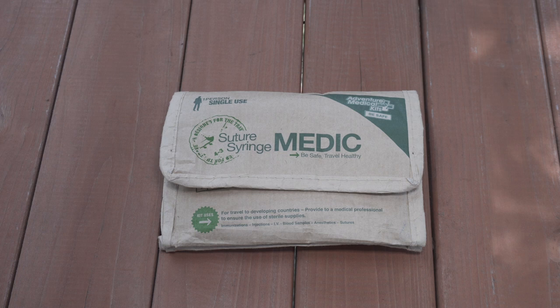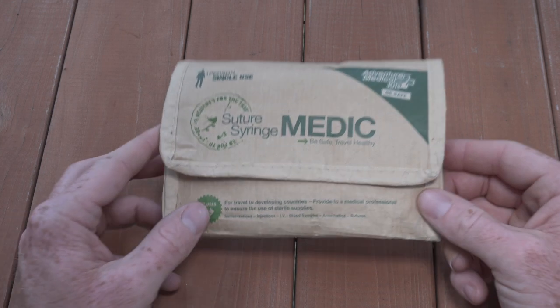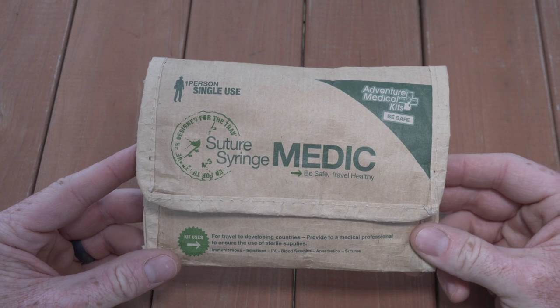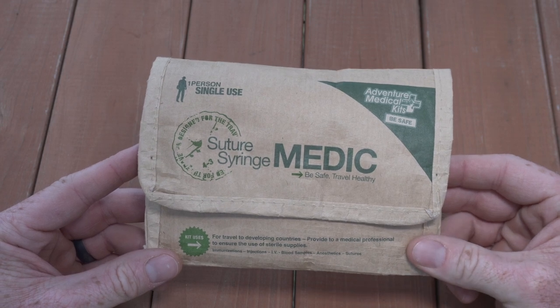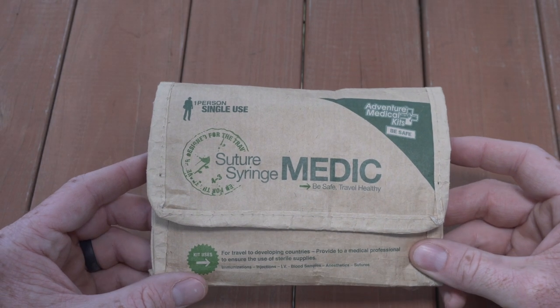There are a lot of cool features about this kit, but there is one thing I want to point out before we get going. This kit is not designed for self-aid. It is designed to give to a medical professional in situations where the availability of sterile supplies may be questionable or unavailable. That's the primary design of it.